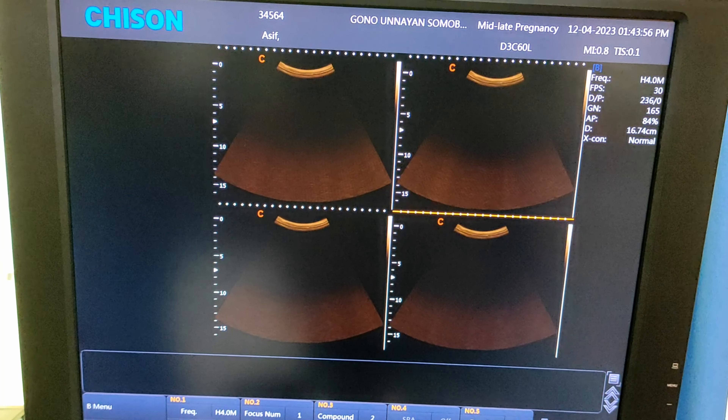Now press the freeze button to freeze the image. Now press the calculation or calc button. Now select the heart — place one point here and move it here, and press enter. Now your heart rate is 139 beats per minute.